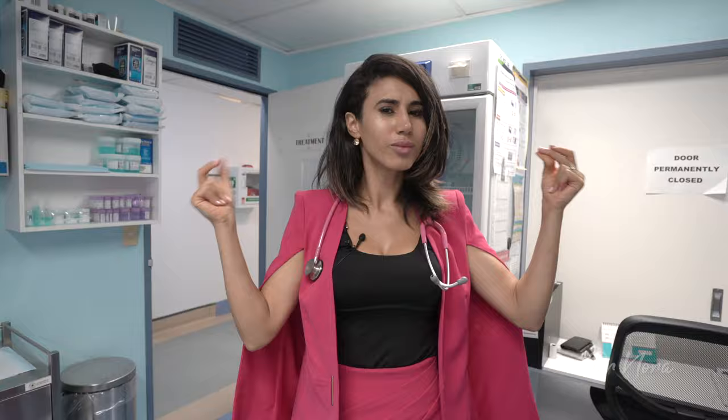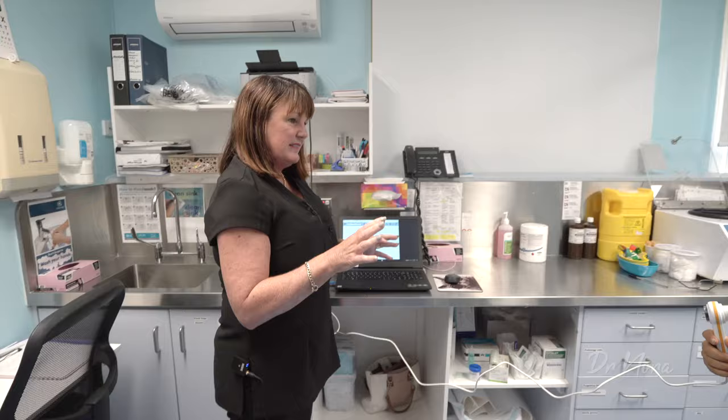Now we've seen how a female performs, it's time to check out a male set of lungs. For this, I'm going to need a model. Welcome. How are you, Ash? Take a seat. Nice and tall, shoulders back. When I tell you to, take a deep breath in.